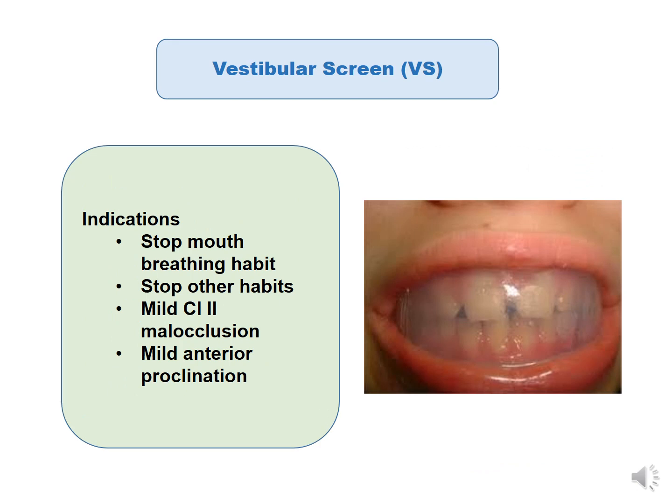Now, the indications of the vestibular screen are to stop mouth breathing habits, and it is also able to stop other habits. It can be used in mild class 2 malocclusion as well as where there is a mild proclination of the anterior teeth.